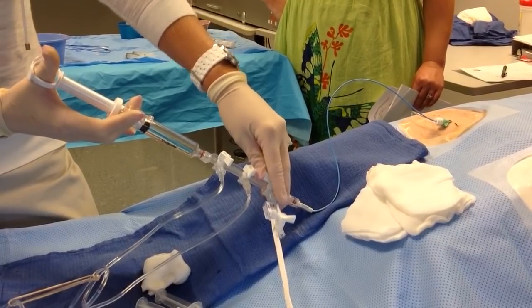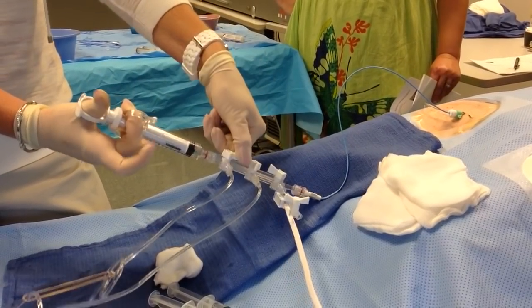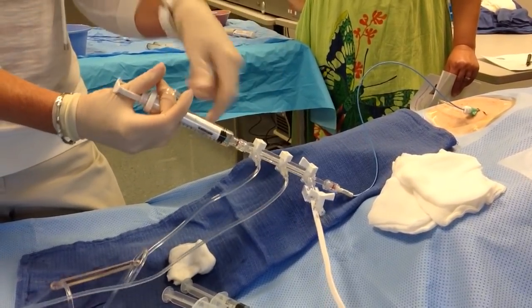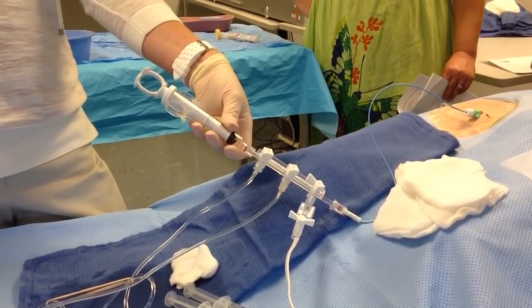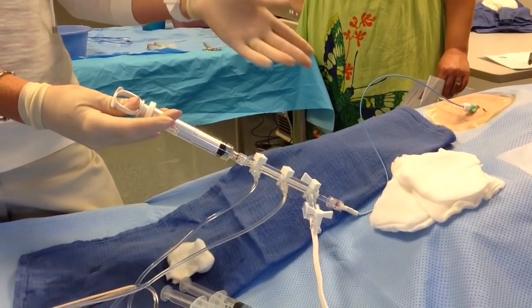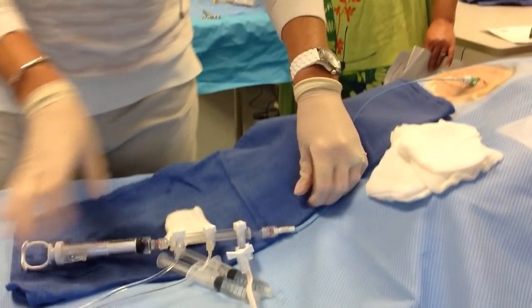Okay, so then we're ready here. Take a picture, and you do inject. Like, it's kind of hard to inject, so you have to really give it some force. You go back on pressure, you get more contrast. We take another picture, 5 to 8 mLs. And you're not watching this. Like, am I doing 5 to 8? No, you're looking at the screen, and you know by the force of the injection and the blowback of contrast into the AO, you know how much you need to inject. Okay, so you're not worried about whether you're doing 5 to 8, but that's the typical injection. So we would do about 5 to 6 of those. Okay, when we're done with that, we disconnect.